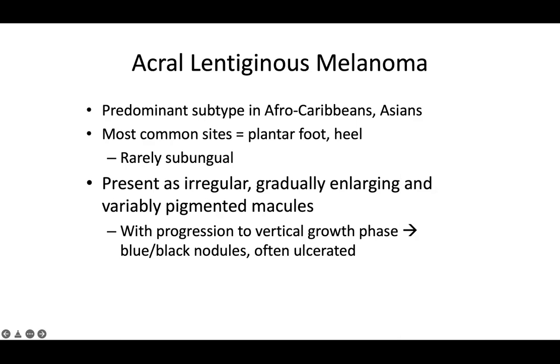And so you'll have involvement of atypical melanocytes, not only at the ridges, but at the peaks and the furrows. And so you'll want to use your dermoscopic technique to make sure that you're getting that pattern in place before you do the biopsy to correlate clinically.